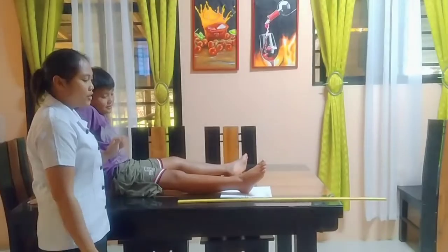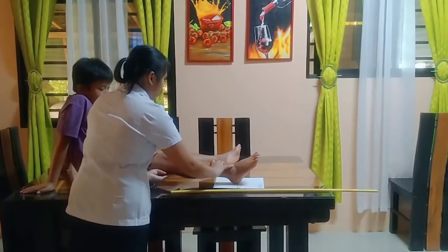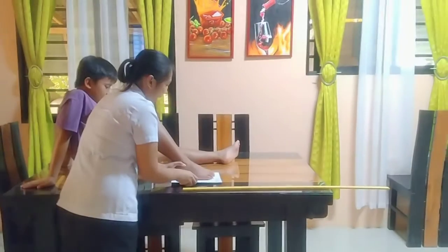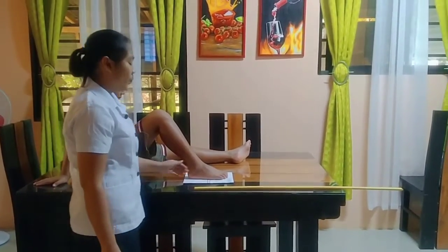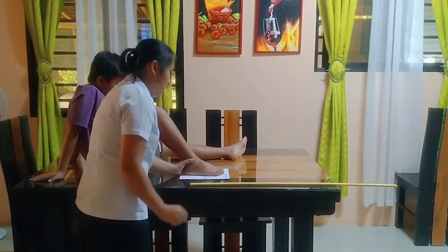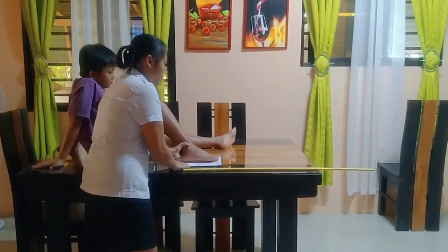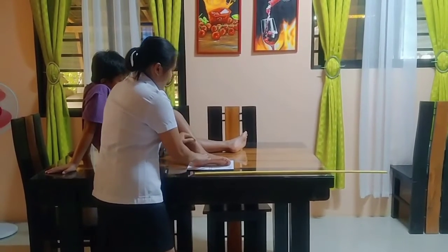Next projection will be the lateromedial oblique medial rotation. So, in this projection, we need to flex the knee of the patient, placing the plantar surface at the center of the IR. Now, we have to rotate the foot 45 degrees medially.